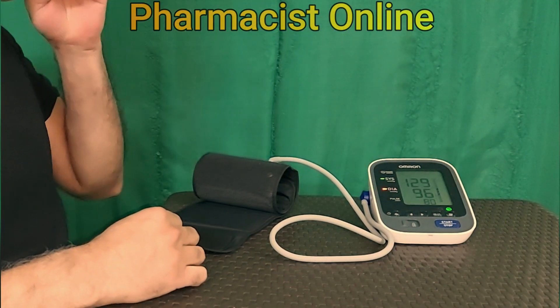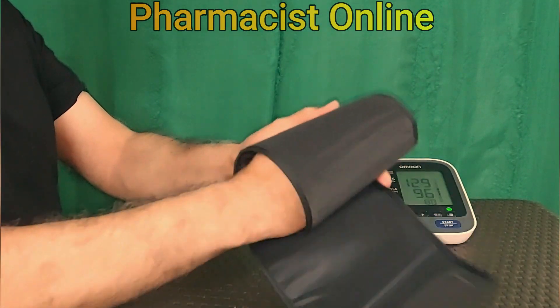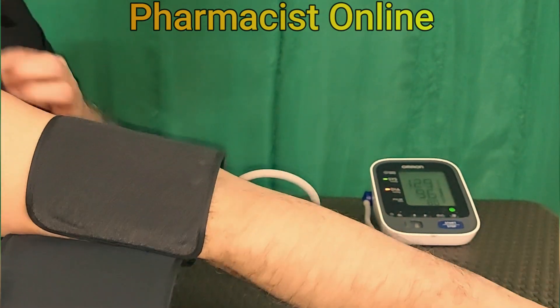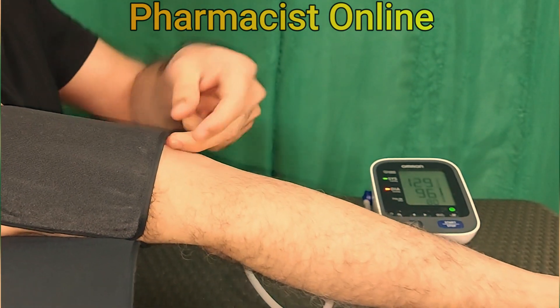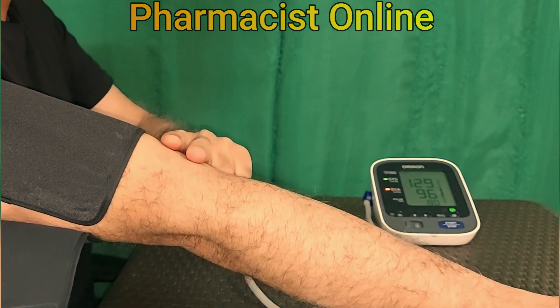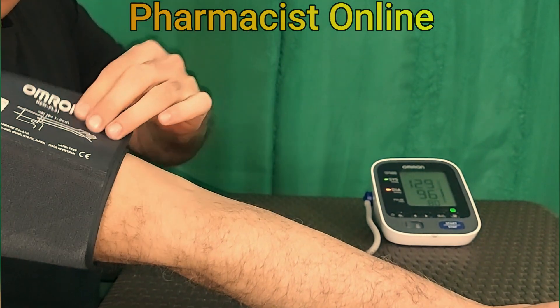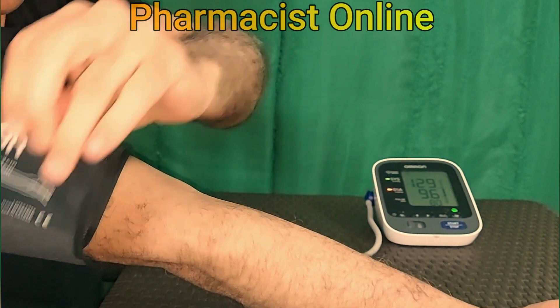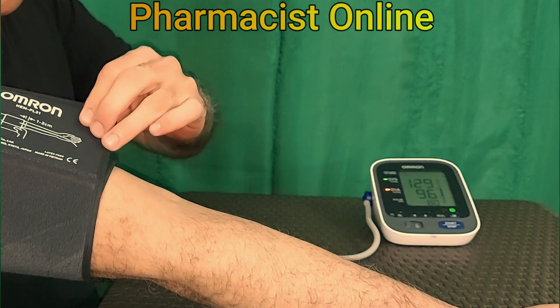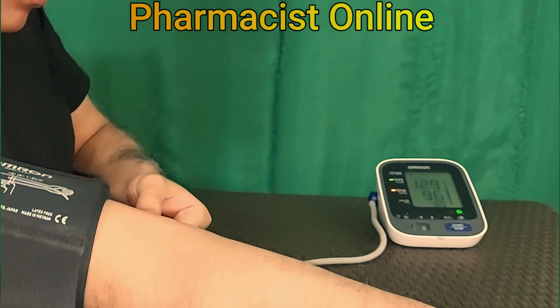For some people, the left arm shows higher blood pressure. To place the arm cuff on the left hand, take the arm cuff and wrap it properly around the left arm, as shown in the video — 2 cm above the elbow. Make sure you tighten it properly, not too tight and not too loose.